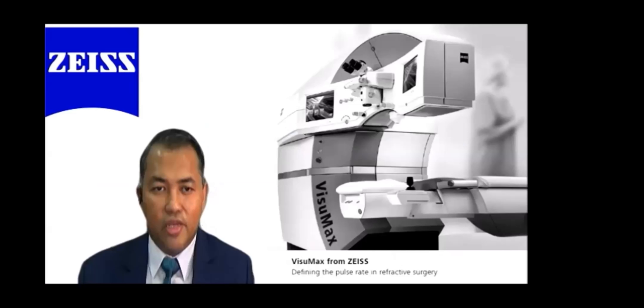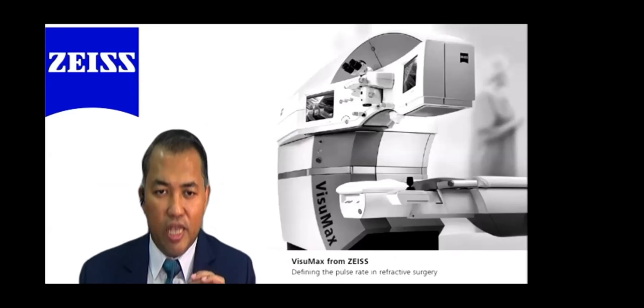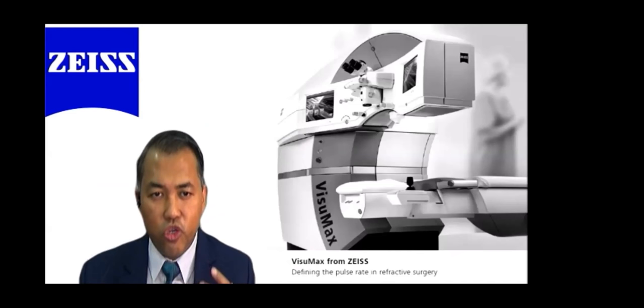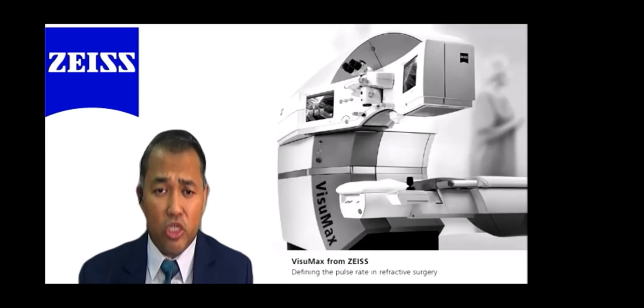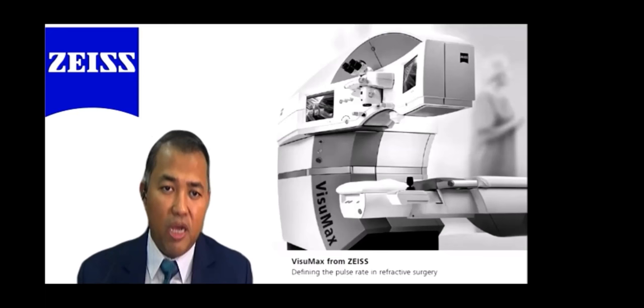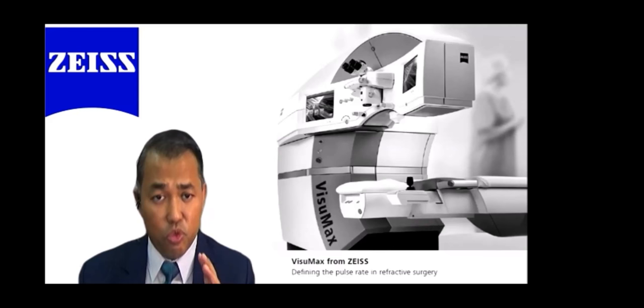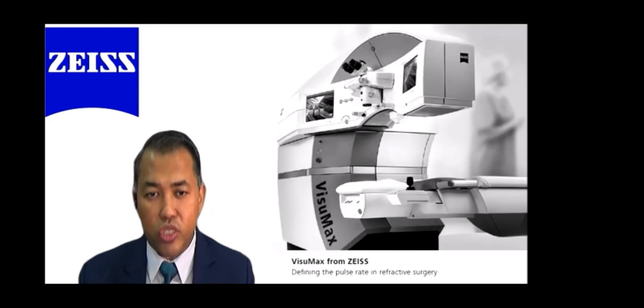SMILE stands for Small Incision Lenticular Extraction. It is a new addition to the laser refractive surgery treatment modality, which was first introduced by Carl Zeiss about 13 years ago. The first publication was actually in 2008. It is also known as ReLEx SMILE, where ReLEx stands for refractive lenticular extraction. SMILE utilizes a single laser platform, which is actually a femtosecond laser, to create intrastromal keratomileusis with minimum disruption to the anterior portions of the cornea.